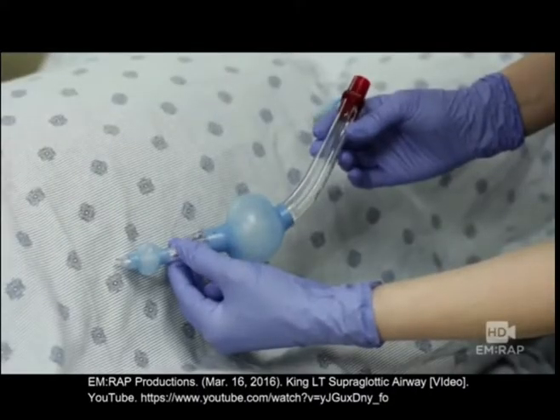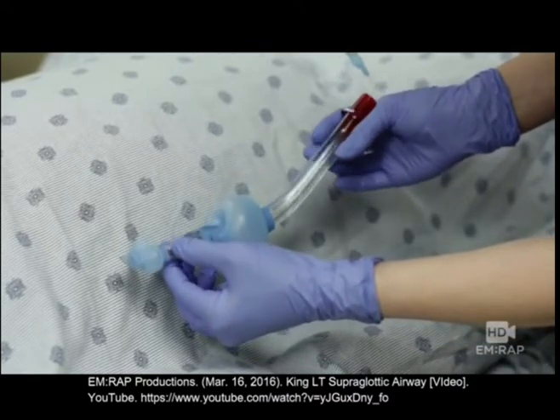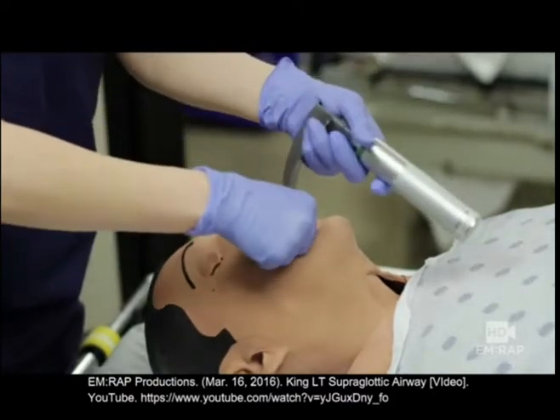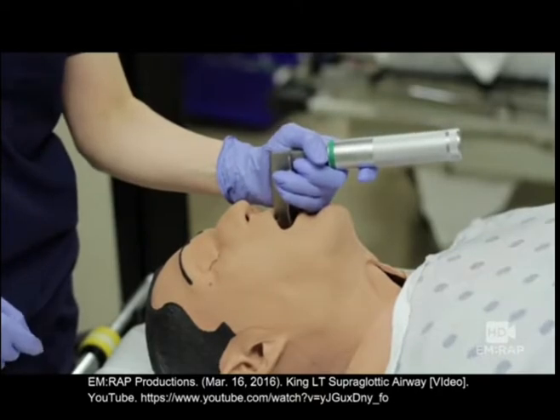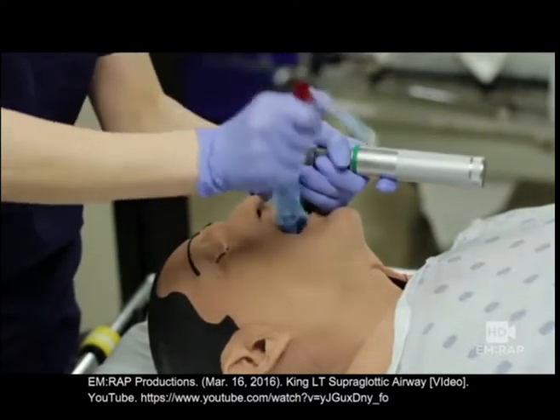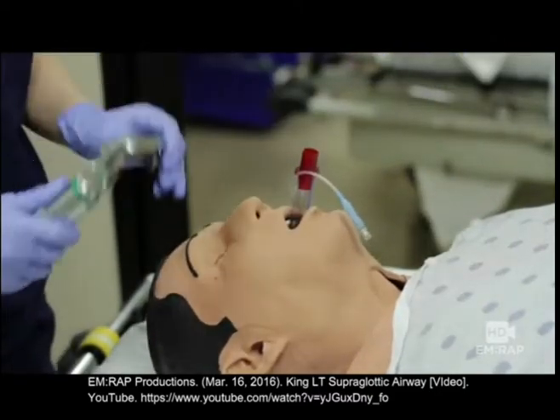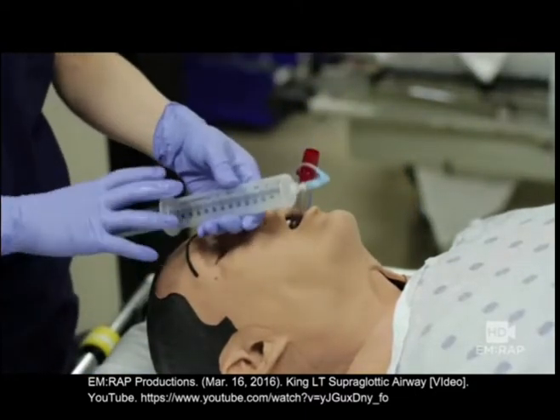This is the King LT supraglottic airway, and this one's a size 4, works well for large adults. A size 3 works well for smaller adults. To insert it, lift up the chin and the tongue, or if you prefer, you can use a laryngoscope. Now, when you pick up the King LT, pick it up from the connector, and you're going to insert it using a lateral approach until you get past the tongue, and then bring it to midline. Insert it until the connector is at the teeth. And you're going to inflate it with 60 cc's of air. It's a lot of air, 60 cc's.